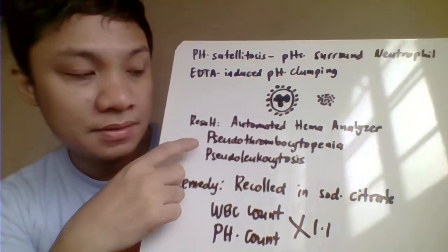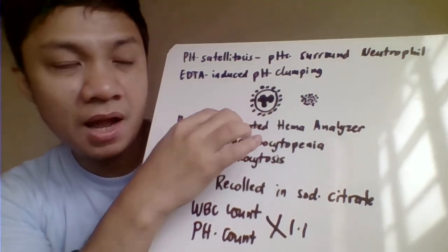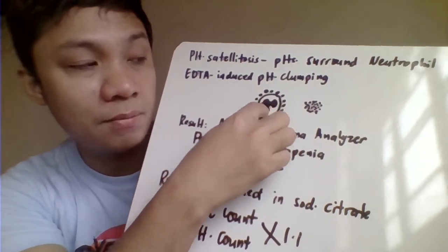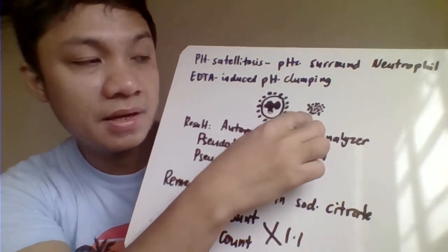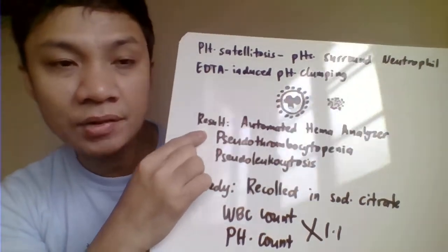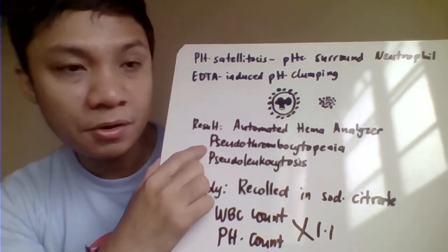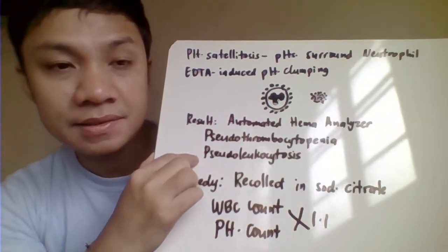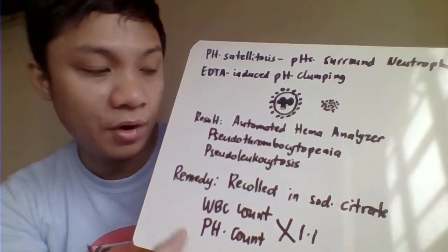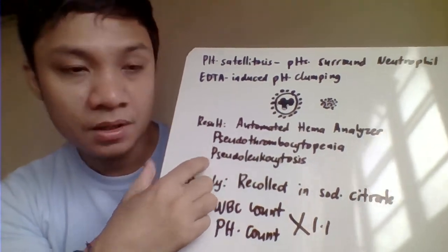So the consequence, since they are not recognized as platelets, is that the analyzer does not see small particles, and it assumes this is a WBC, or the clump could also be identified as WBC because it forms a bigger particle size. Therefore, what will be our platelet count? The platelet count will be decreased, which becomes your pseudo-thrombocytopenia. On the other hand, since the hemanalyzer thinks we have many WBCs, but actually those are platelets that formed a clot or clump, the WBC count increases, which becomes your pseudo-leukocytosis.